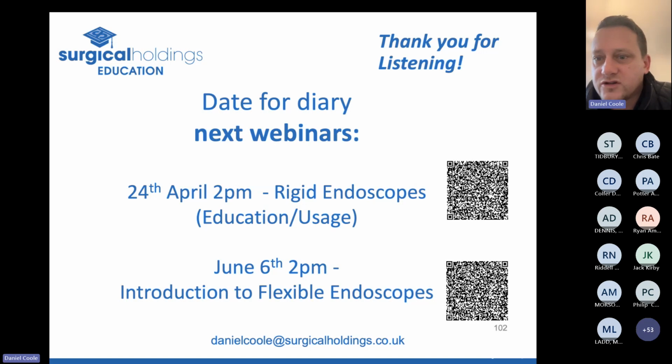So, a question around the sprays that are on the market to keep instruments moist as per HTM requirements. Can these damage the instruments? We've tried out a couple of them and haven't found them to damage the instrument, but I think it's like everything. You've got to do your due diligence and check that the spray you're going to use, how has that been tested?